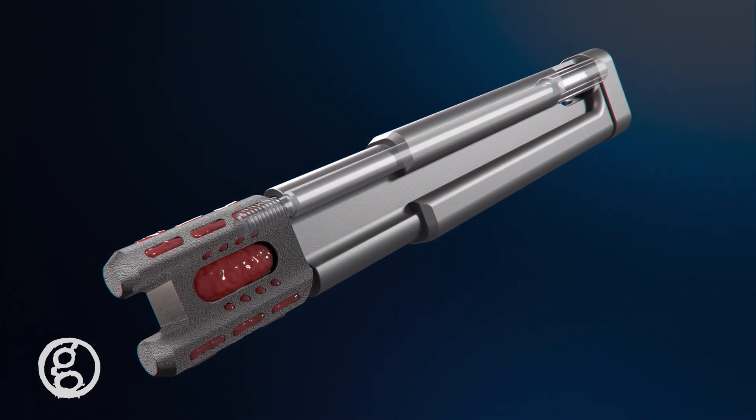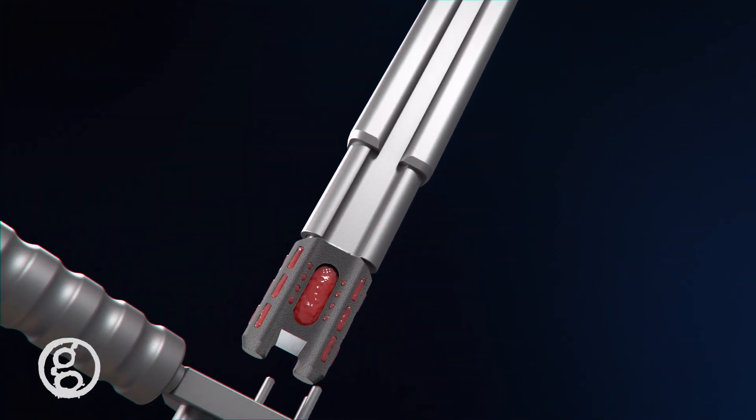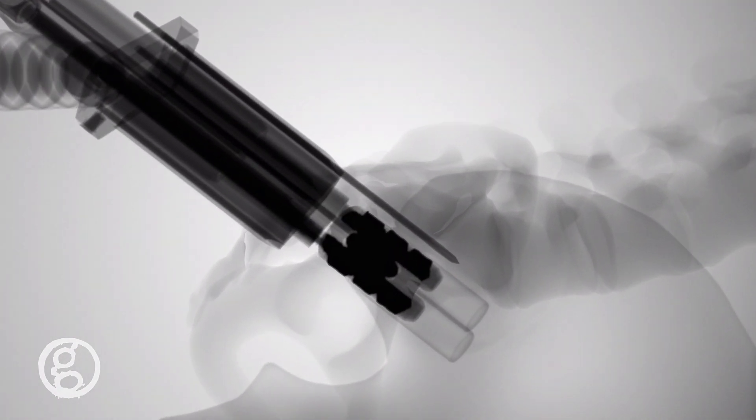The inserter screw is threaded into the Catamaran implant and delivered into the access sleeve. As the implant is tapped into position, the osteotome bridge is designed to decorticate the joint.